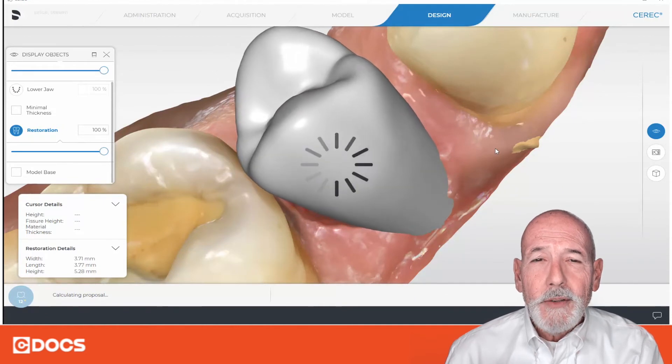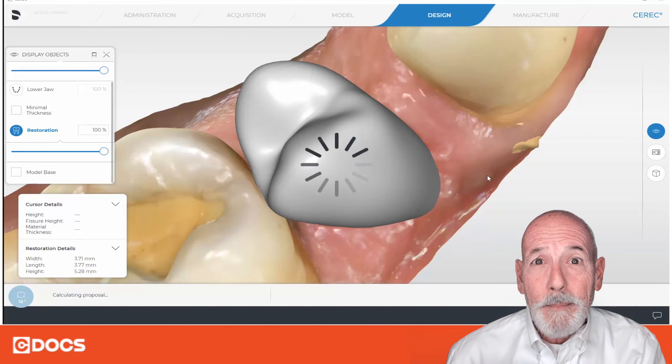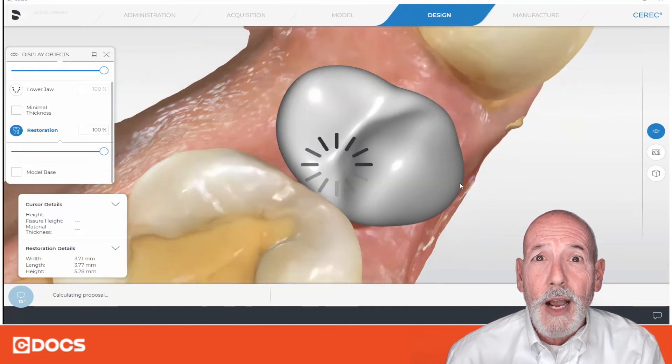Now, this proposal is going to take a little bit of a while because it's not your regular type of proposal since it's on a stock abutment. But as you'll see here in the end, we get a much better situation to start with than we had immediately when this was presented to us — when it was all doubled over on top.